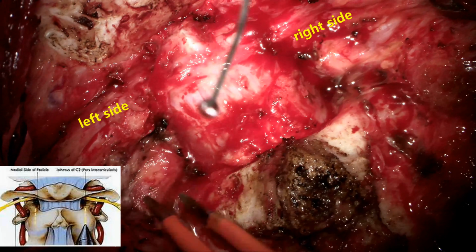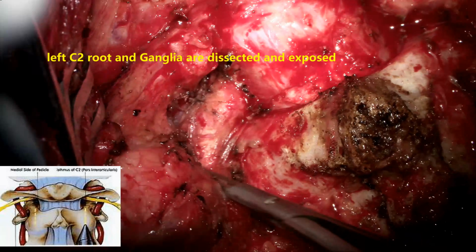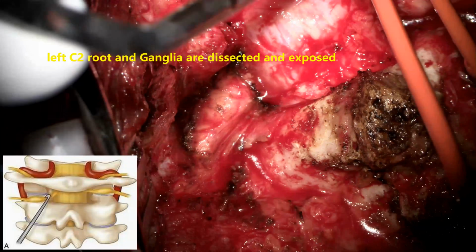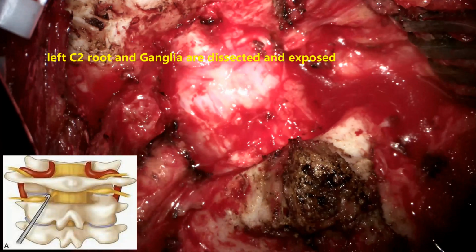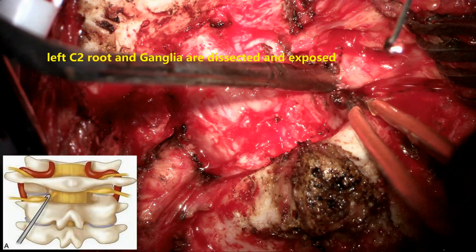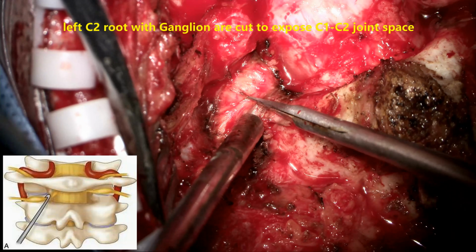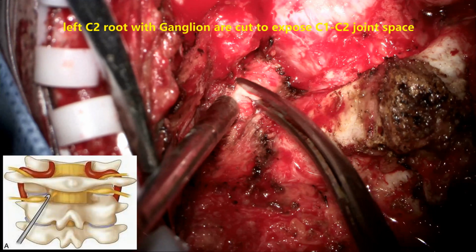We prefer in these cases to dissect these C2 nerve roots and ganglion and cut them, to have a wide exposure of the C1, C2 joints. In subsequent stages, because of the irritation of the screw, if the root is preserved there, it may cause pain in the suboccipital region and neuralgic pain, and there may be difficulty for the patient. So we prefer to dissect the nerve root and excise it and expose the C1, C2 joints. That is, the C2 nerve root along with the ganglion is divided and cut.